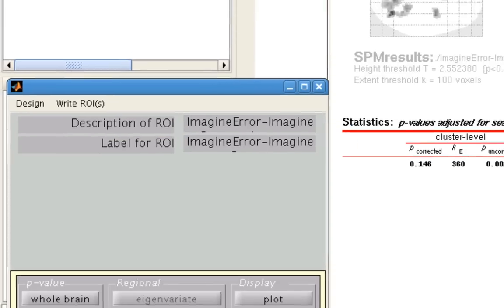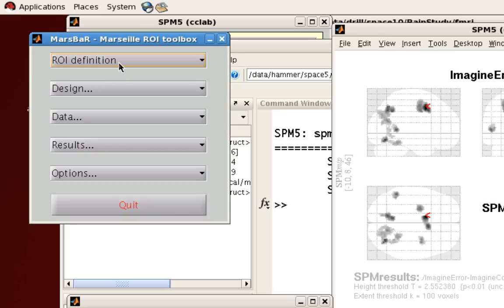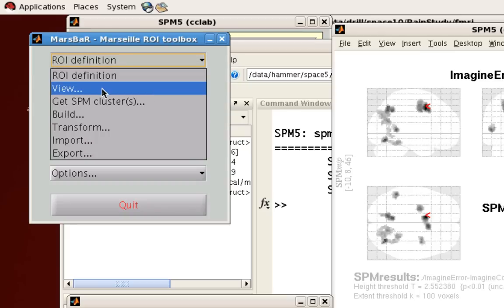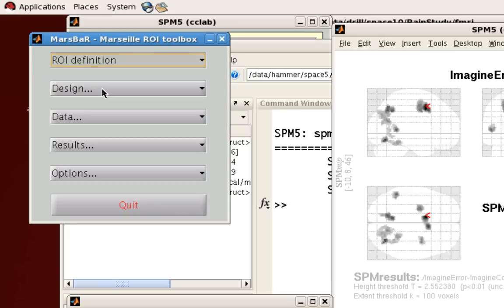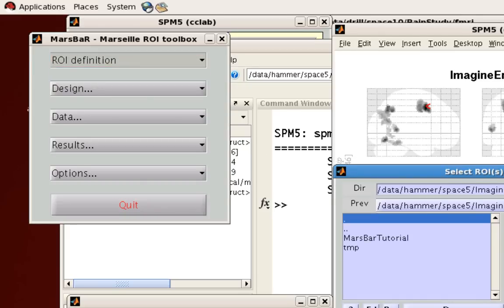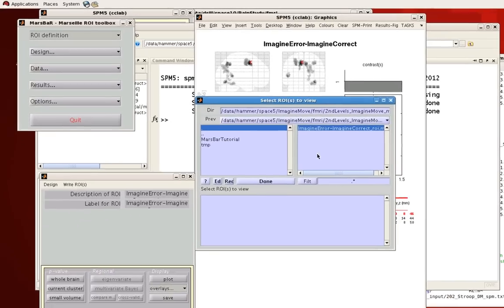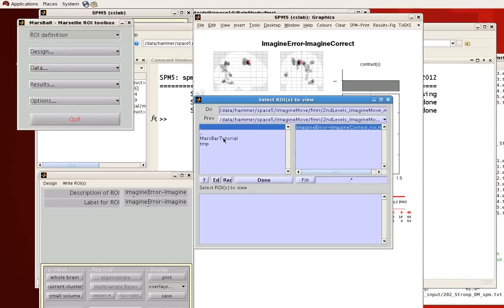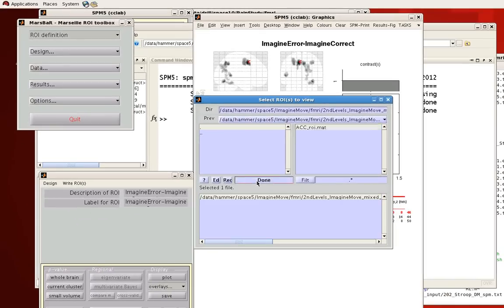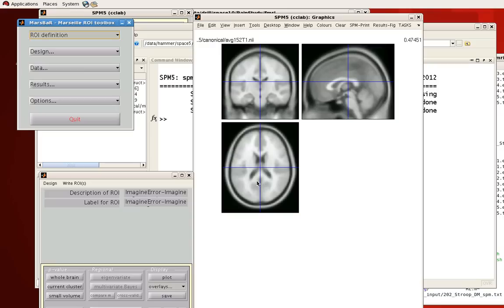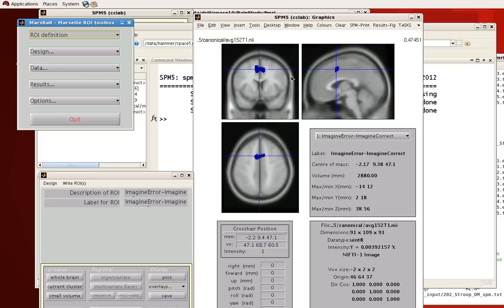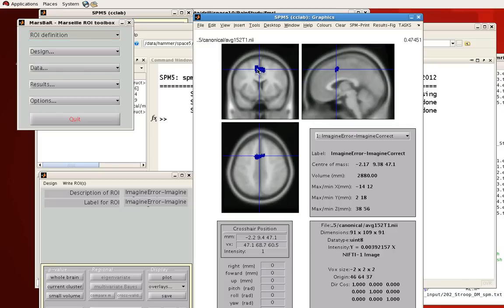And now, again, it's very useful to click on the view to see what you've done to that ROI. So here is the ImagineError-ImagineCorrect. Click Done. And you can see that it does look like what I looked at in the results from that other analysis.